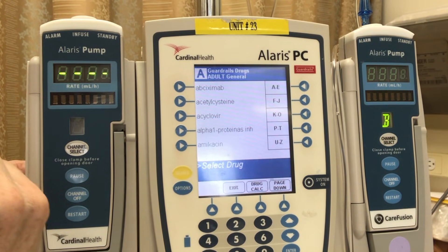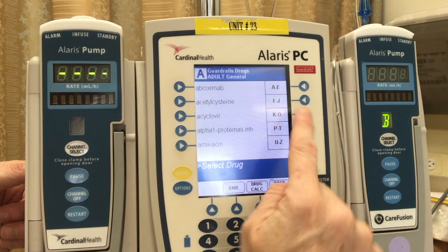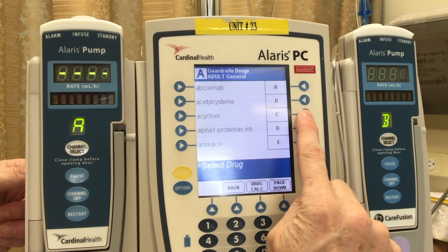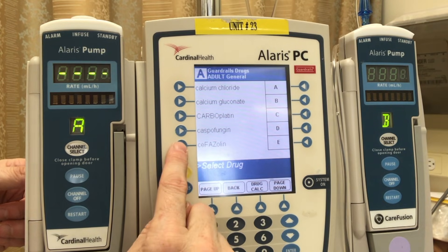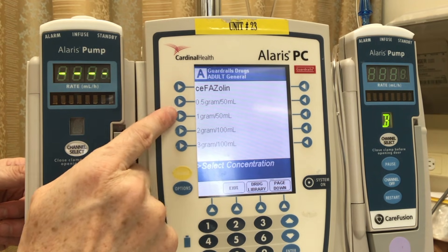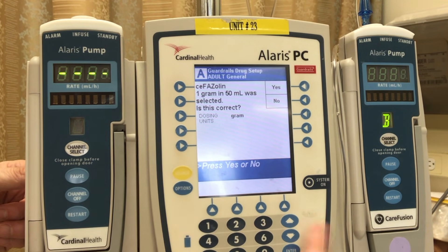Here we have a menu of medications that you might be administering to your patient. You'll notice the right-hand side has a menu we can also select — it has groupings of medications, for example A to E, F to J. Selecting one of those breaks it down further, which quickly allows us to find the drug we're looking for — for example, cefazoline — and select it. You can see we already have pre-programmed doses in the machine, so you simply need to select the one that you've mixed up: one gram in 50 mils, as an example. The machine will ask if this is correct — we'll select yes.